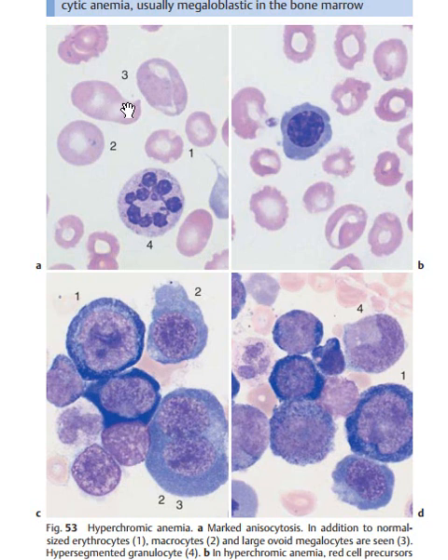Is it clear? This one is the normal size, this one is large size, and this one is mega large size. That's why this one is called a normocyte, this one a macrocyte, and this one a megalocyte.